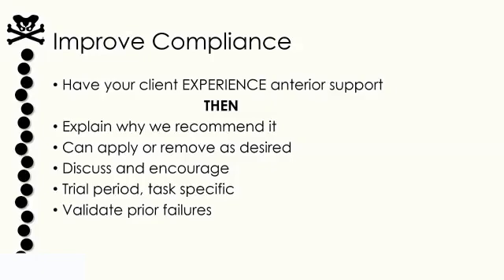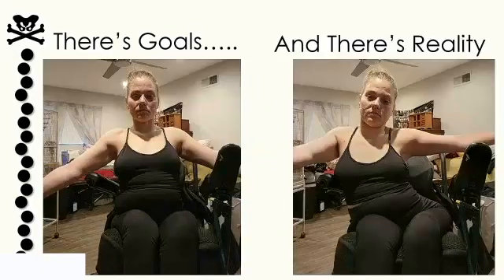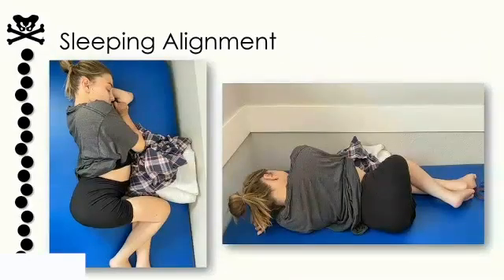I also try to validate previously. People have tried to strap them in and it hasn't worked, so I validate prior failures. This is a funny one. She sent me, this is where I think I sit, and this is where I actually sit without my belt. We have to realize that people are going to assume different positions for different times of the day or functions, and it's not always going to be as pretty as we'd like it.